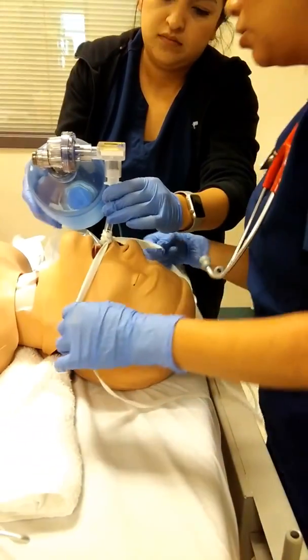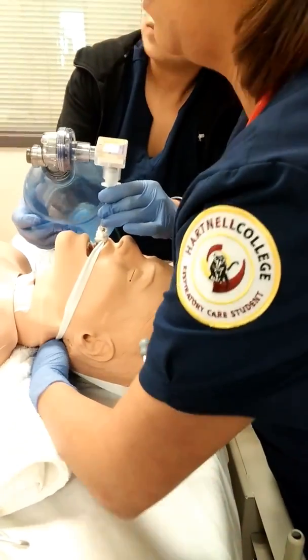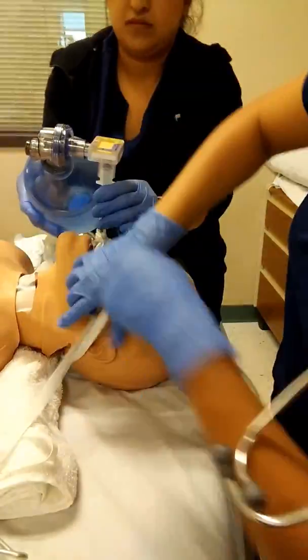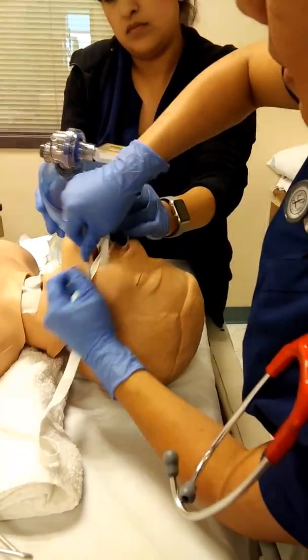Okay, and so then we just want to go ahead and put this underneath the patient. Okay. We want to make sure that it's nice and tight.